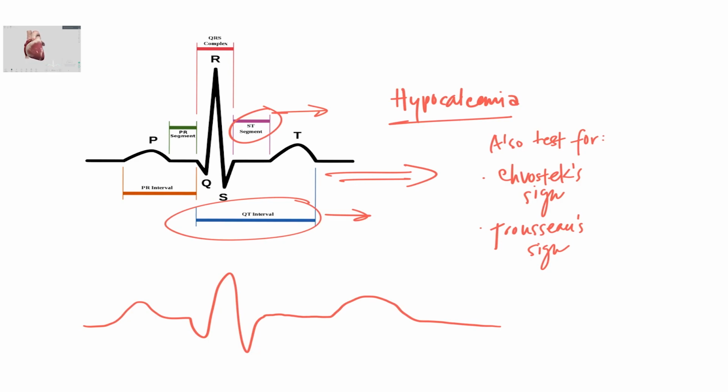Hypocalcemia, not enough calcium, that affects, let's see here, we got a lot of blue. So again, mostly this part of the EKG wave deals with, yes, the ST segment again, but doesn't really work with the T because that's mostly for hypercalcemia, but without enough calcium, the T is left alone. However, the QT interval is prolonged, and the ST segment is prolonged too, so it's really long. Wait, maybe the T is fine, but the interval is long. There, see? T is okay, but it's just far away from home.